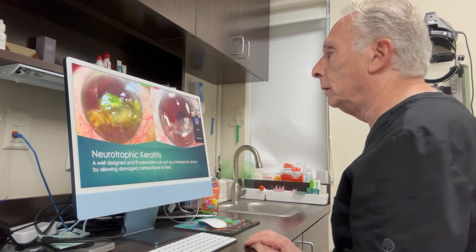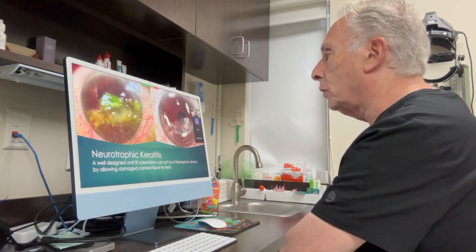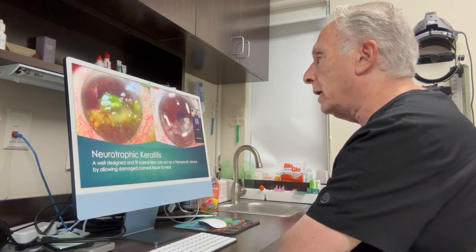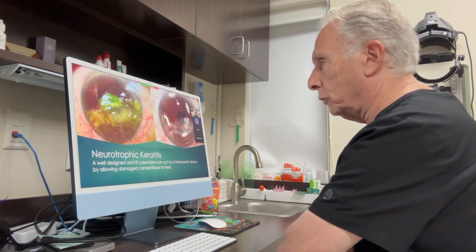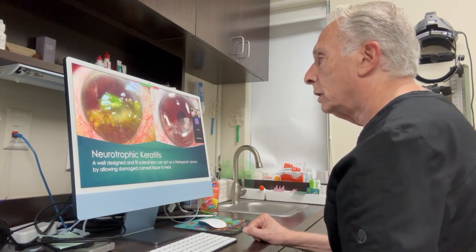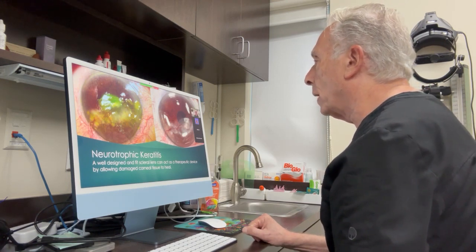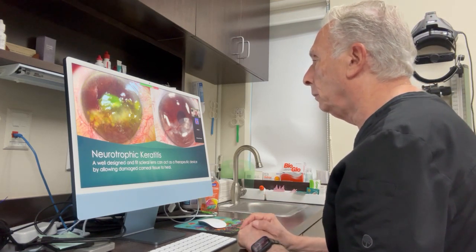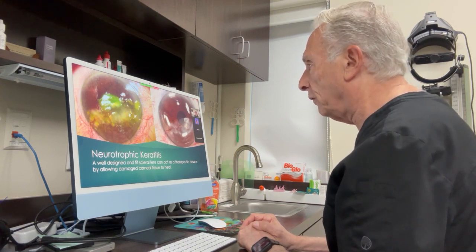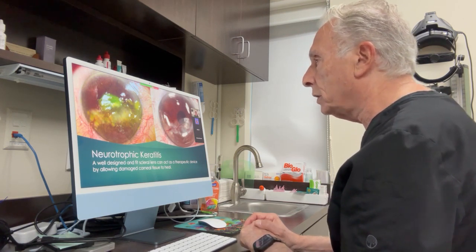This is a patient that had a neuropathy, an acoustic neuropathy, and was unable to close the eye. The left photo is from the first day the patient visited us. Visual acuity is basically hand motion. We designed the scleral lens for the patient to wear 24 hours. The picture on the right was taken around 7 or 8 months later. Visual acuity after 7 or 8 months was around 20/25, after wearing the scleral lens almost continuously. And you can see the healing effect, the therapeutic effect of a well-designed scleral lens.